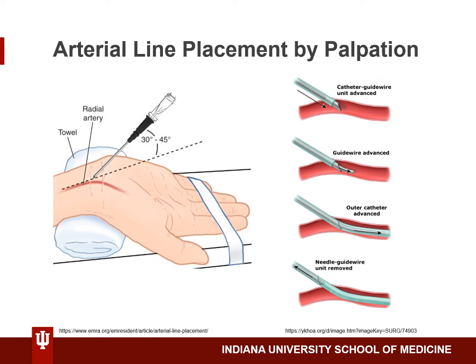After localizing the radial artery, use your dominant hand to slowly introduce the needle, bevel up, at a 30 to 45 degree angle relative to the skin, advancing slowly until you observe pulsatile blood return through the needle. At this point, decrease the angle of the needle so that it's closer to parallel with the skin, then advance the guide wire through the needle.